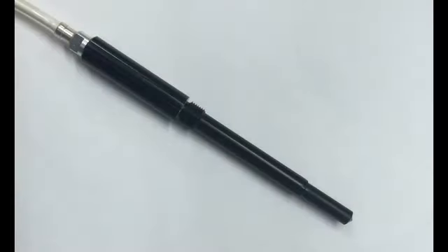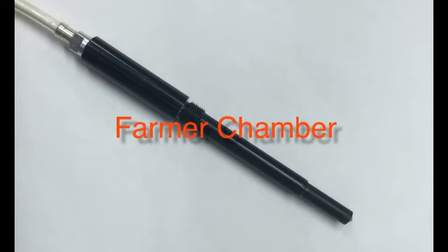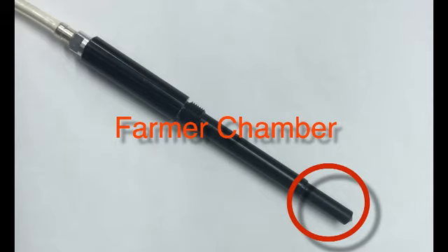So I'm going to start with one particular important type of chamber here. This is called the Farmer chamber, after the person who invented it. And you'll see it's a cylindrical geometry. It's called a thimble chamber sometimes. The active area is down here. I'm going to focus in on that. So let me draw a diagram of that.